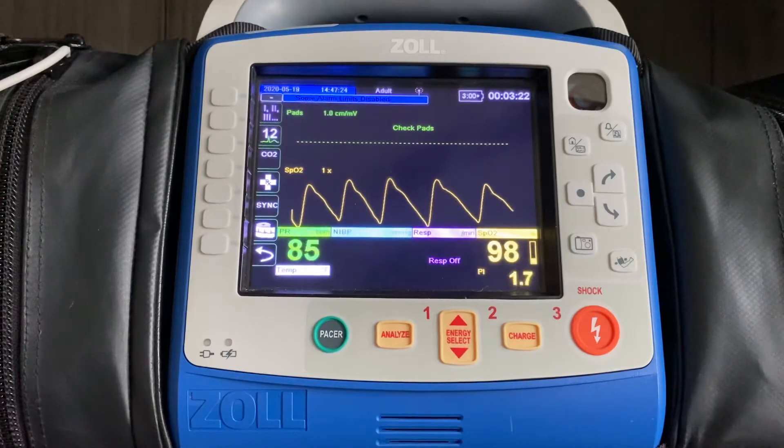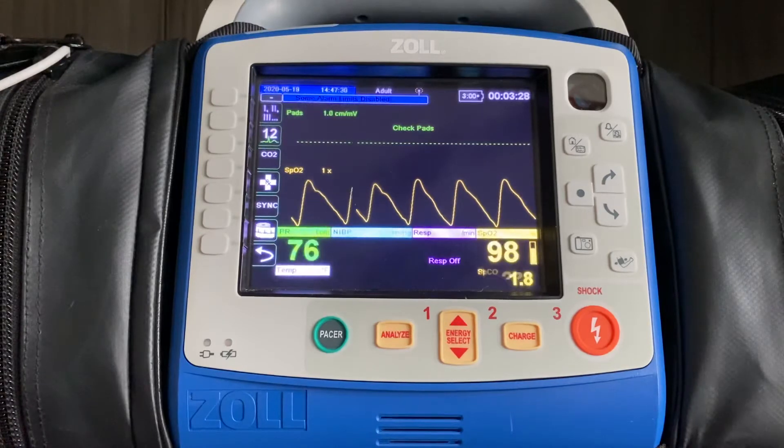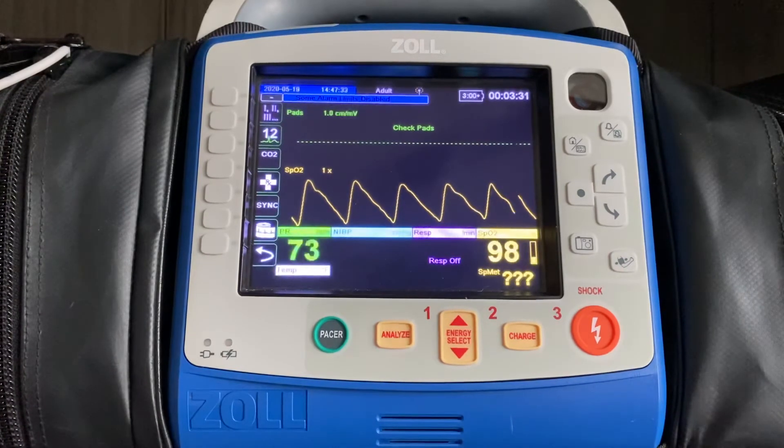Then the smaller numbers, based on your configuration, are going to present SPCO for carbon monoxide. This monitor also has SP-methemoglobin monitoring. And then that last value that we keep seeing flash here is the PI number.